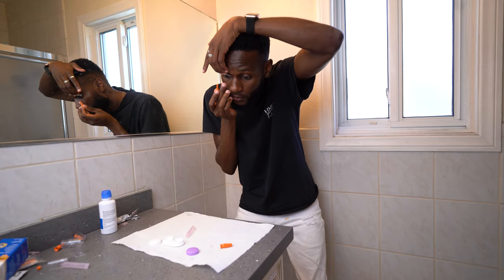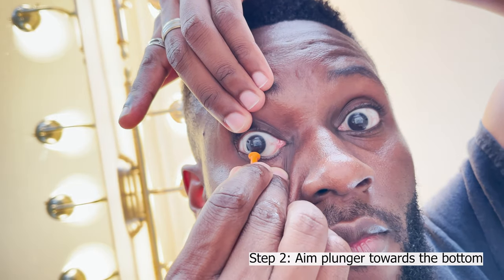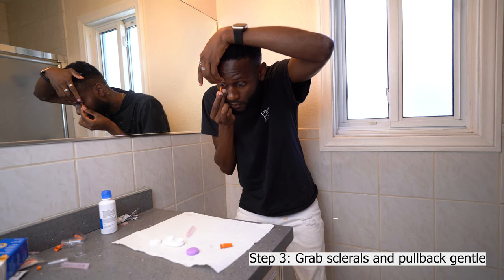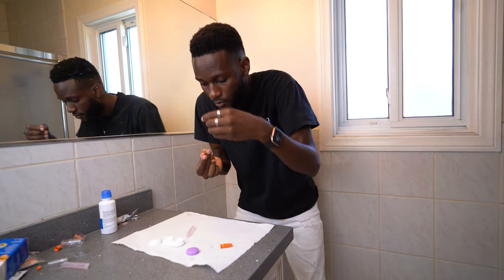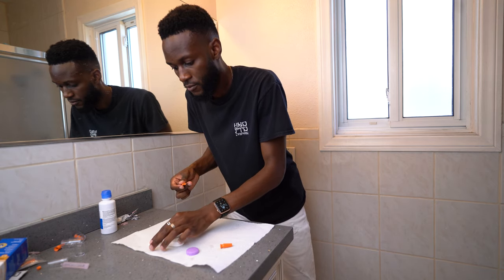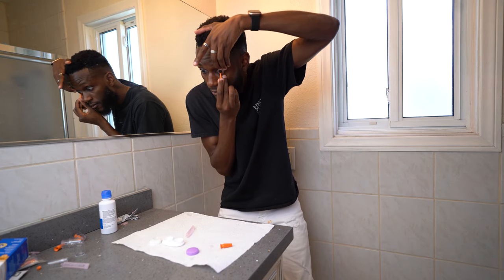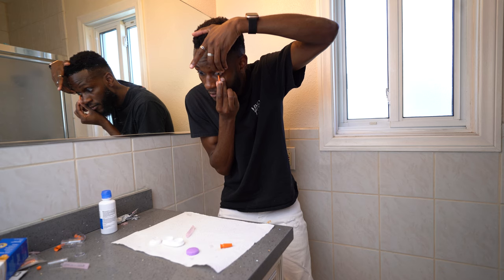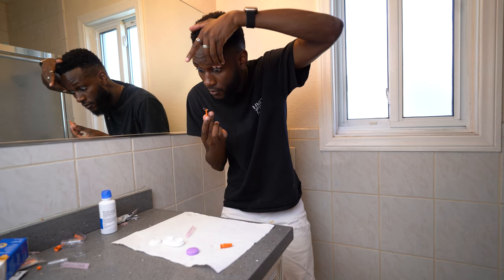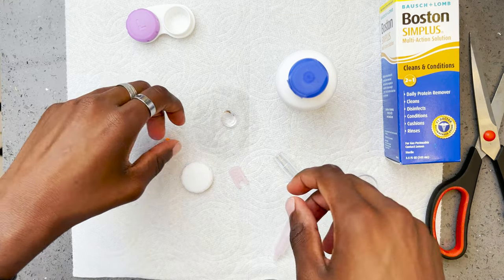Recap for removing the scleral lenses: make sure you open your eyes wide, aim towards the bottom as much as possible, and just pull down gently. It should come off really easy. Do the same for the other eye towards the bottom, and voila — you should be good.